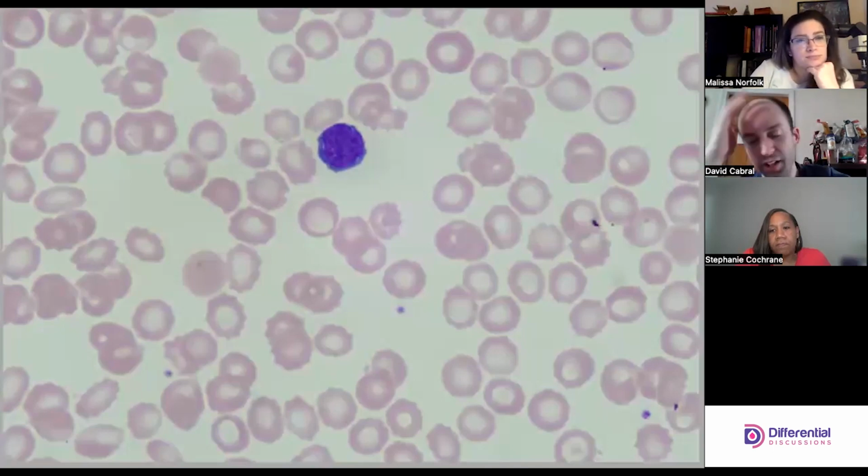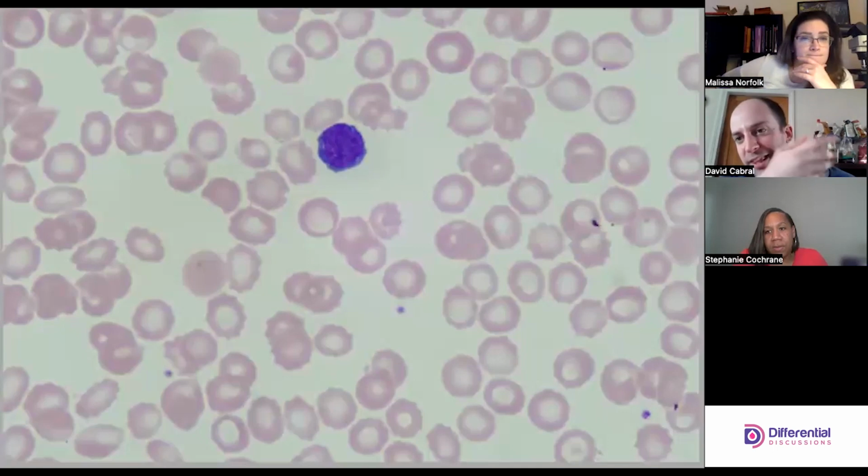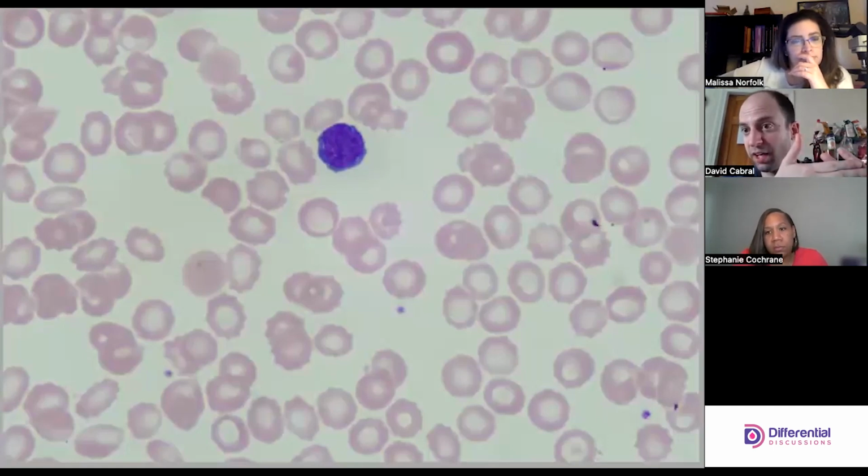I think you're right though. The burr cells are tough, right? Because that's not usually a clinical picture for our aplastic anemias. And a 0.7% retic is not crazy low, right? Isn't normal 0.5 to 2.5? Is that for adults? Is that for children too? I think that's for adults. I don't know children off the top of my head. But if we corrected the retic for the anemia, the signal to the bone marrow should be profound at this point, right? For erythropoiesis. So at an 8-gram hemoglobin for a 7-day-old, did they say it was a female or a male?